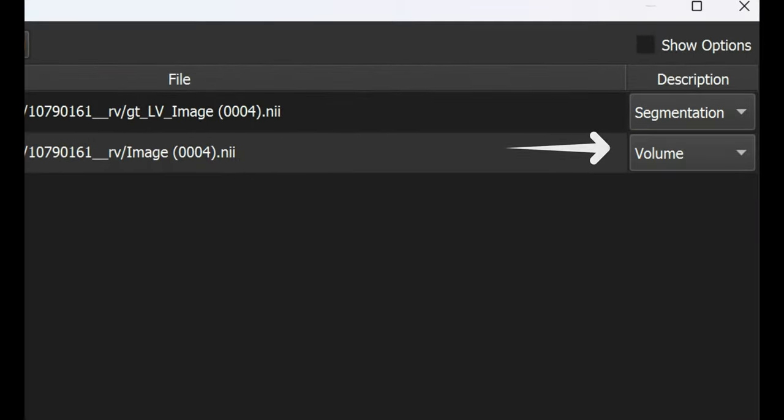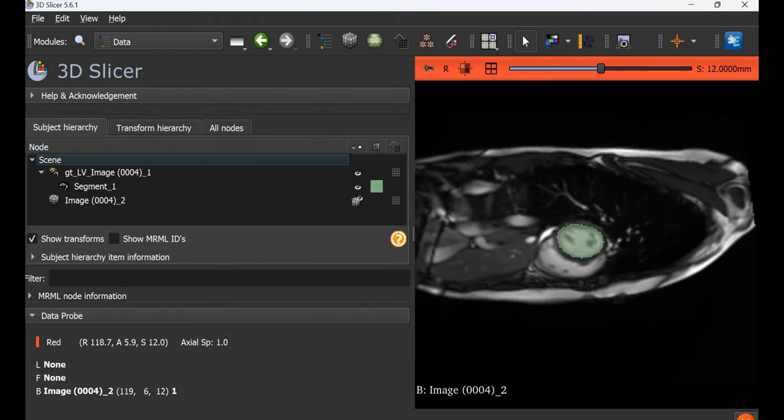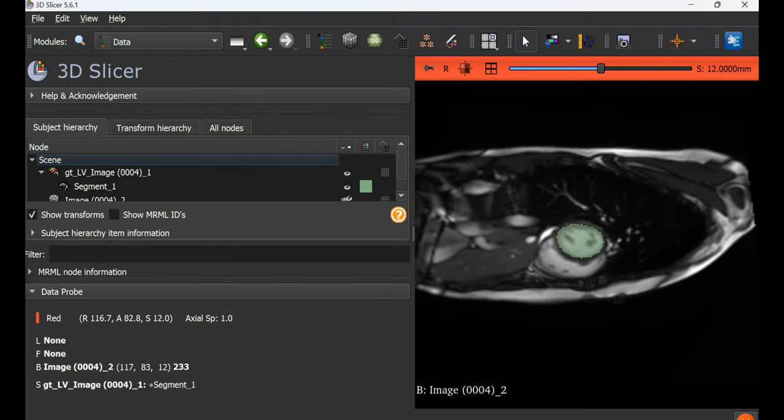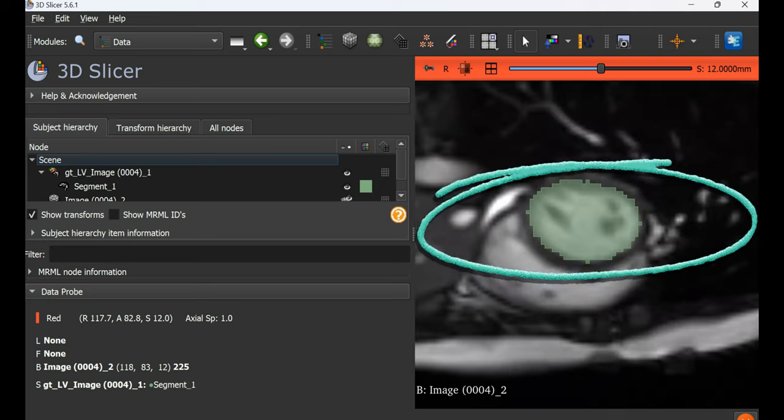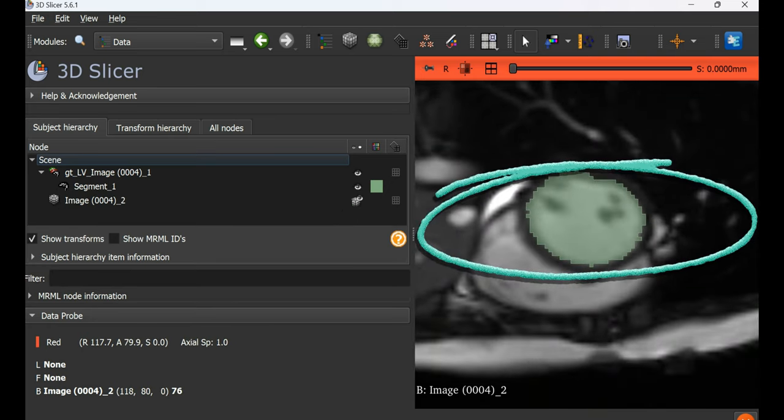The image is labeled as volume and the mask is labeled as segmentation. After this, 3D Slicer automatically shows the masks overlaid on the image.